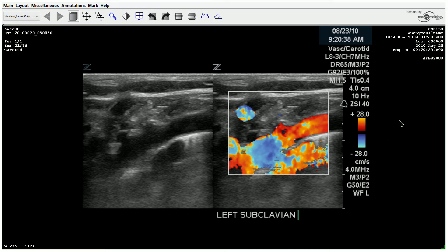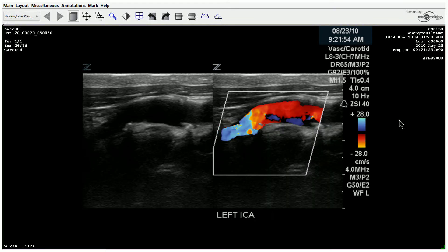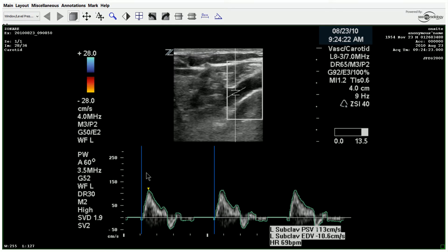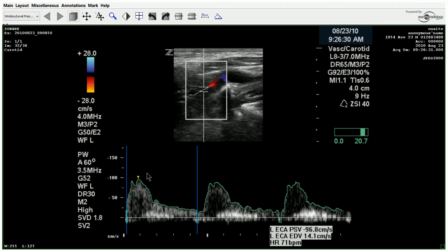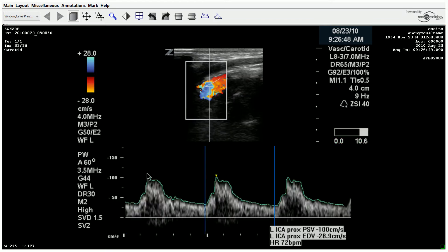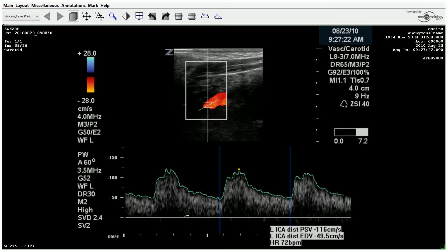Moving on to the left side. There's also a little bit of calcification here at the bulb and proximal ICA. We can see the delayed upstroke in this waveform, a lot of spectral broadening, and elevated end-diastolic velocities.